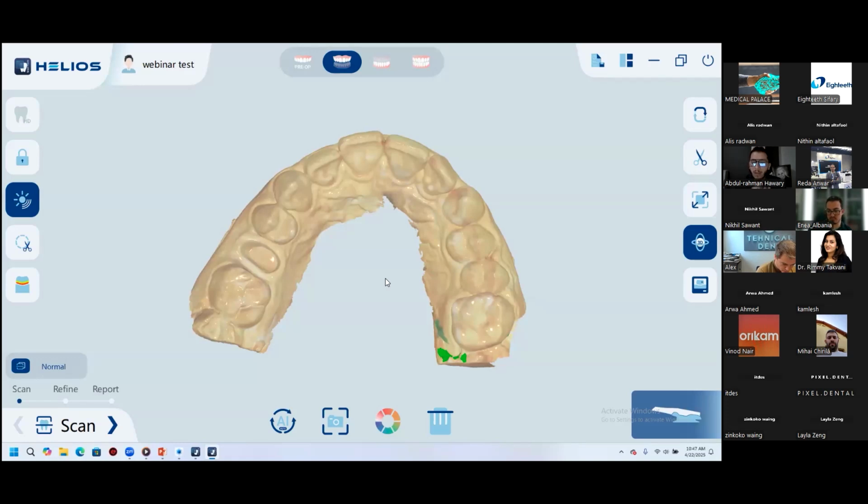First of all, the standard numbers are the same, because the numbers that we always release are the worst the scanner can do, or the worst performance that the scanner undergoes. These are the numbers that we release. The new update decreases the possibility of reaching the worst numbers. So you get the idea.